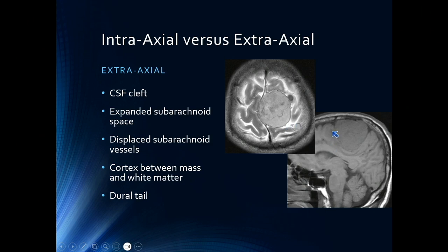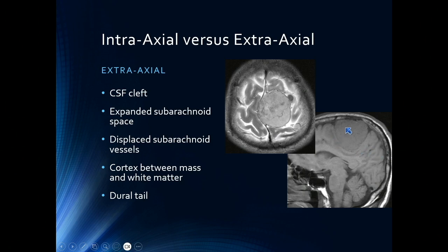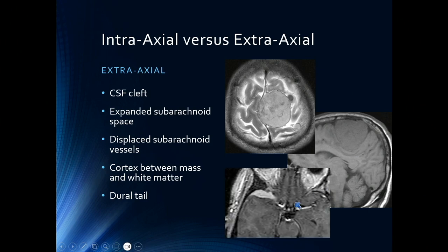You will also see, such as on this T1-weighted image, both the CSF cleft around the mass lesion, as well as cortex between the mass and the white matter. Here you can see that the white matter is deep to this, and then there's cortex in between. And sometimes you will also see a dural tail, such as here, where you see that the dura is broadly thickened with a tail along either side.